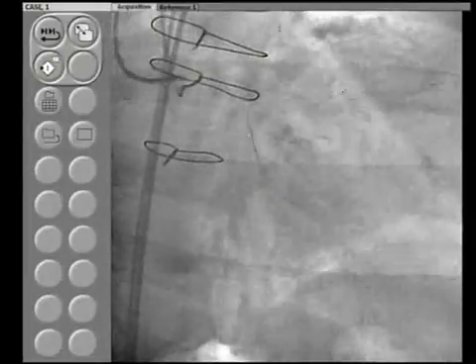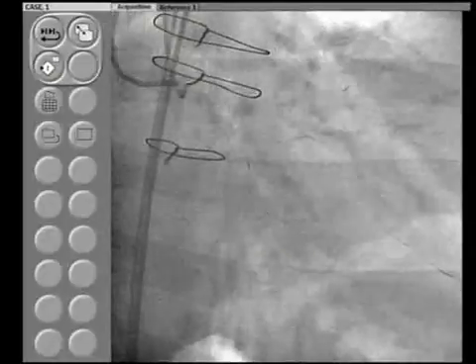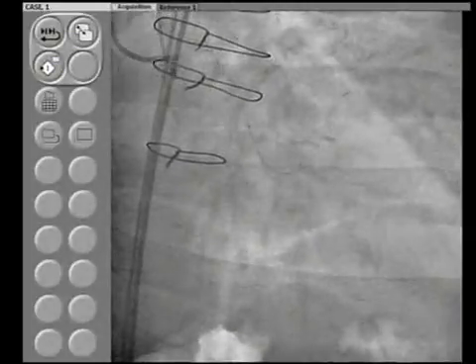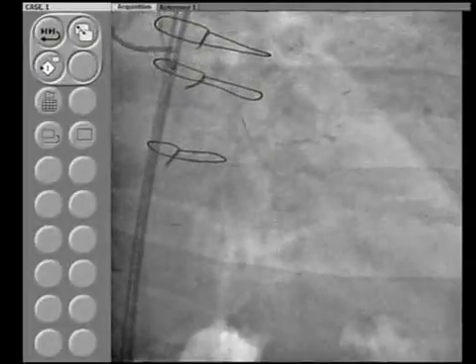Now, the same as we mentioned in our total occlusion strategy in the February case, once you fail once, rather than causing an extensive dissection and putting multiple stents, it's reasonable to let it heal and bring the patient back after 2 to 3 months, and then you'll have a better chance of succeeding. Often you may even be surprised, it may heal very nicely and then require just a little bit of work distally.